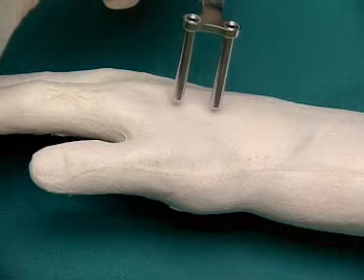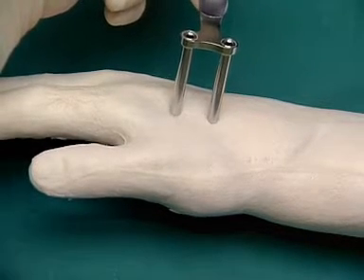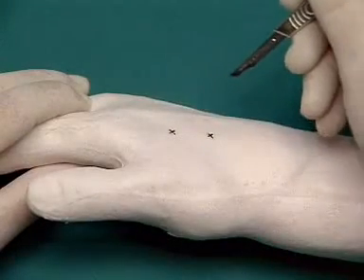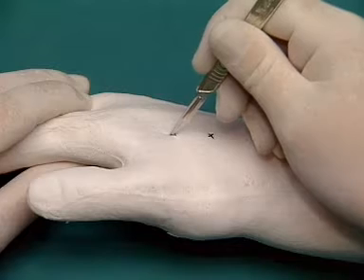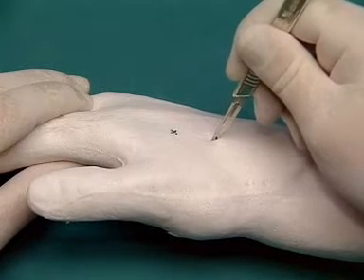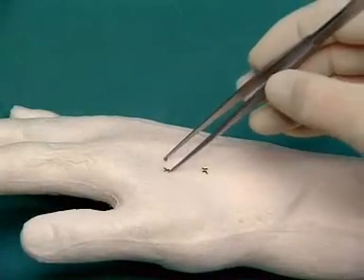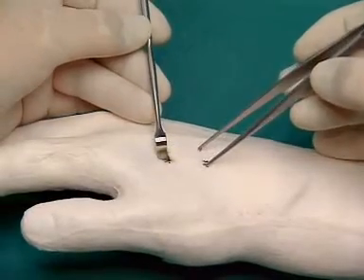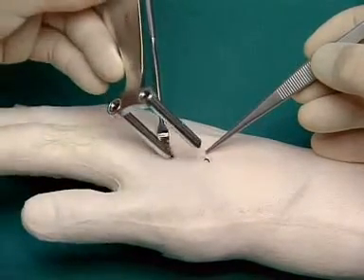For marking the necessary incisions, the parallel drill sleeve is placed over the second metacarpal. One centimeter skin incisions are made in the area of each of the two markings. After blunt incision, the parallel drill sleeve is placed onto the index metacarpal.